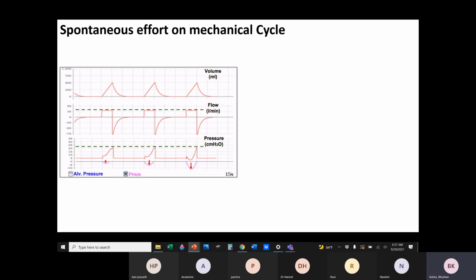So the peak airway pressure does not change too much, will change eventually if the muscle pressure becomes too much, but it starts getting scooped out, and the flow remains constant because that is what you set on a volume control ventilation, and the tidal volume stays constant. This is because part of the flow and part of the tidal volume got delivered because of the patient's negative pressure. So the ventilator has to drop the pressure. The system will depressurize. Okay, what will this do?